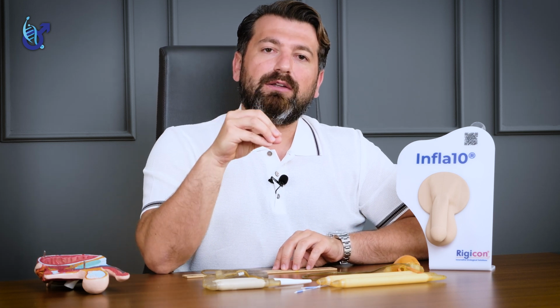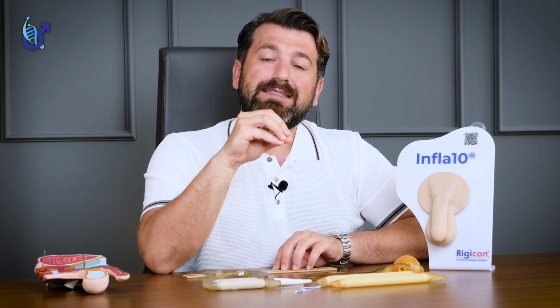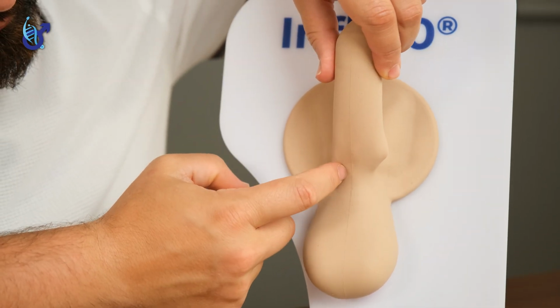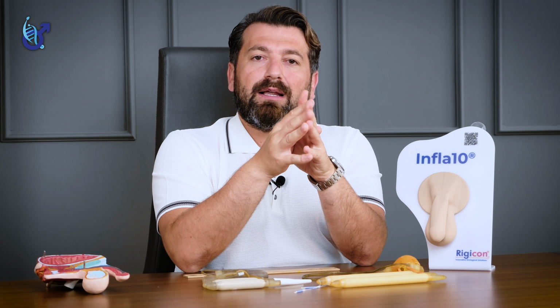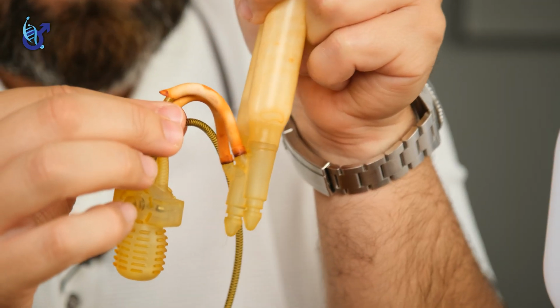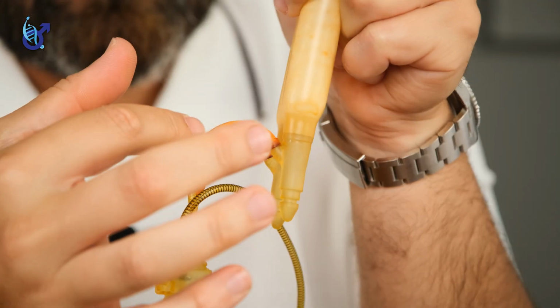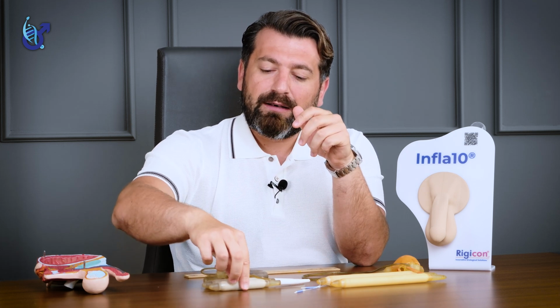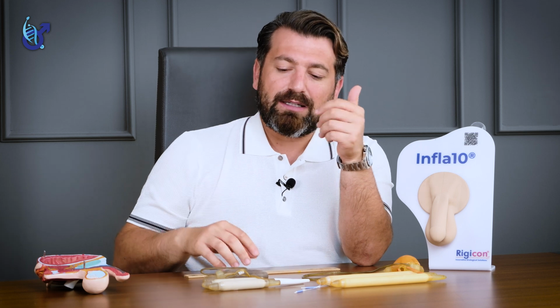to calculate the right implant for your body, because when we do a distal corporotomy, a corporotomy very close to the penile head, it impairs our perfection in penile implant surgery. When we put the corporotomy distally, we have to use longer rear tip extenders to preserve the angle of the cables that are coming out of the implant. When we use longer rear tip extenders, we impair the axial rigidity of the penis, and so at the end of the implant surgery you can have a hard body but you cannot penetrate the vagina. This is the main problem.